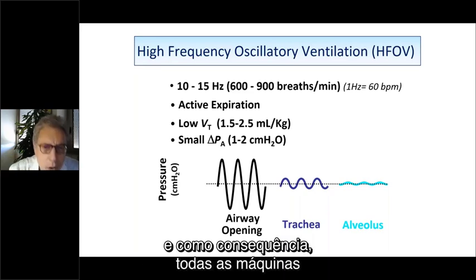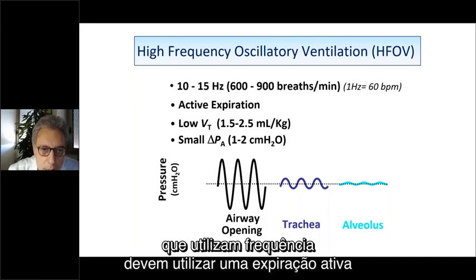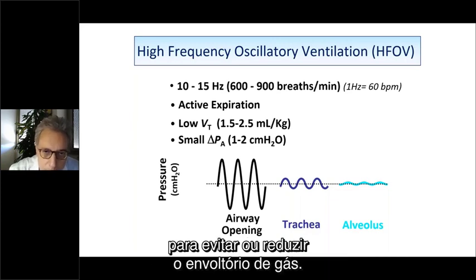As a consequence, all the machines using high frequency have to use an active expiration to avoid or to reduce gas trapping.